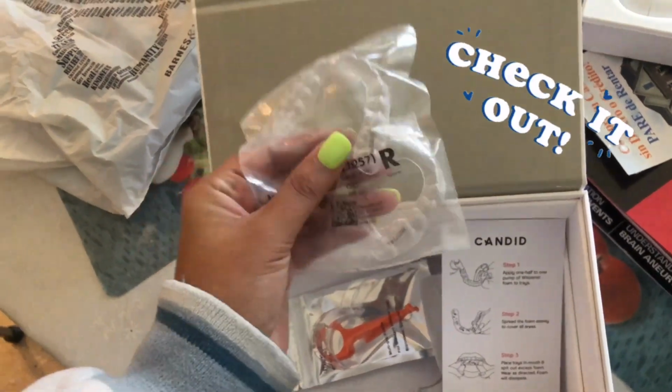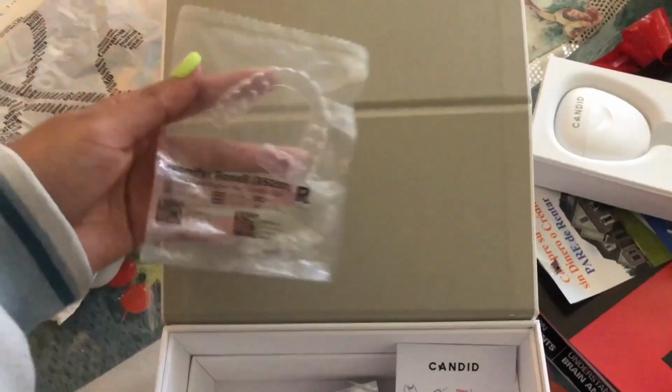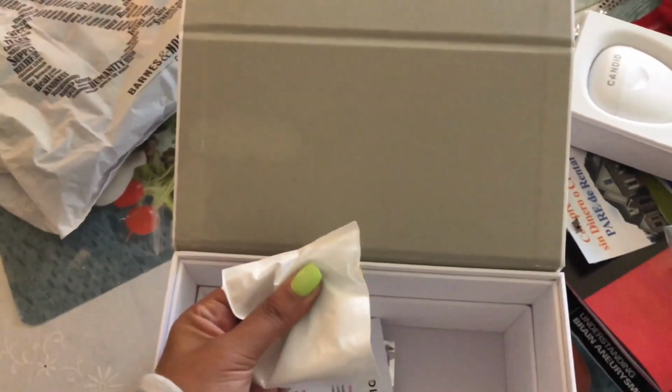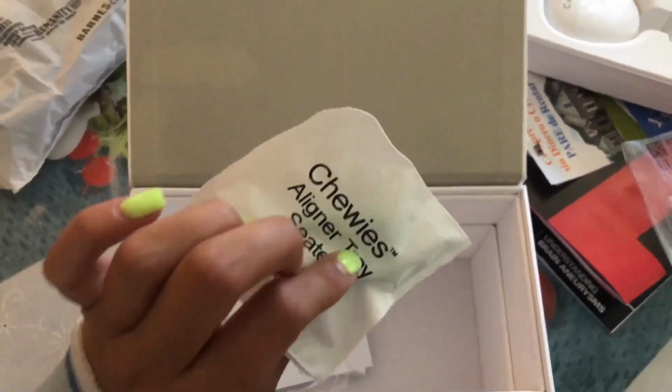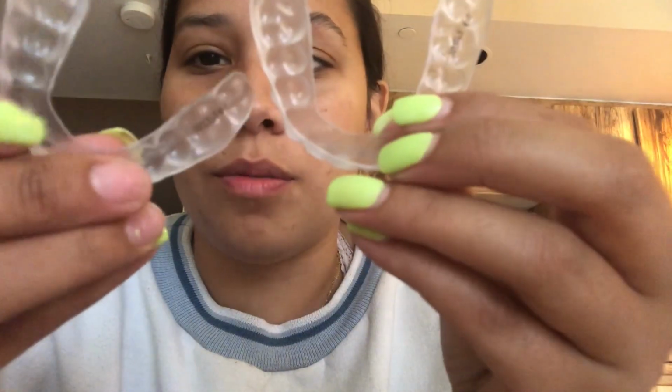This is the last step. You have to wear the retainers for 2 weeks, and then you wear them for 6 months or 3 months to sleep. But I'm so happy about the chewies because my dog chewed all my chewies. So I'm gonna put these on now. My last thing. These are the retainers.